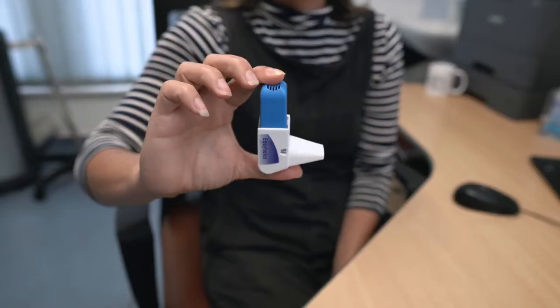It's a dry powder device and is the dry powder alternative to a salbutamol or a Ventolin MDI. The big difference, other than the fact that it has a counter, is that the coordination of activating and inhaling the inhaler isn't needed. So with the Easyhaler, for example, the inhaler is activated by pressing it down and the person can then concentrate on just inhaling, compared to an MDI where the person will need to make sure they've got really good technique where they press down and inhale at the same time. That is a big advantage for those switching to a DPI compared to an MDI. That coordination is no longer needed.